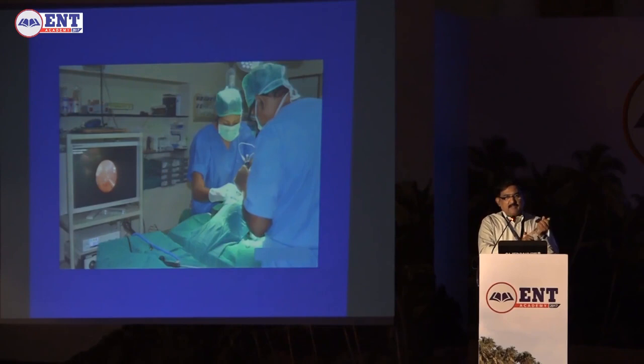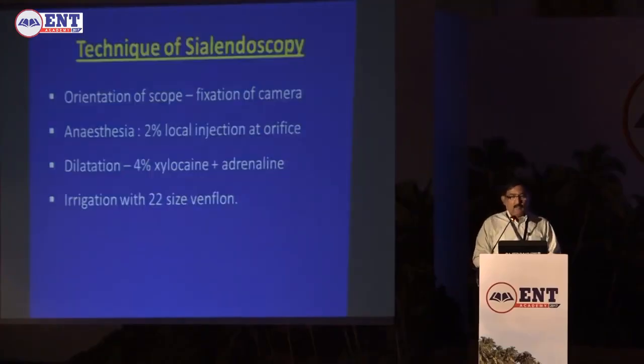especially endoscopes where they couple to your fiber optic cable. That is where rust starts, and you won't even know. But inside, the rust will go into your fiber and the light will become a little yellowish. Soon in your video camera, you will have to white balance more. In one telescope, it will be yellow color, another telescope will be white. That means your telescope is getting rusted where you connect the fiber optic cable. Remove that adapter, clean it well for all endoscopes where water is going to be used.